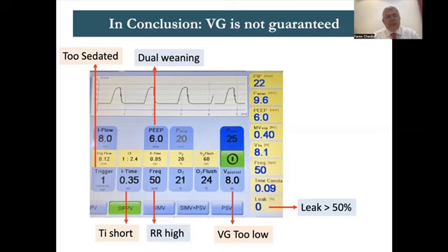Okay, the PEEP itself, as I explained, the dual weaning. If the baby gets healthier, I'm not asking you to decrease PEEP when it's needed, but if the baby gets healthier and you decrease the PEEP, the gradient between the PIP and PEEP will increase, and then as the volume goes up, the pressure will go down later. So decreasing the PEEP will force the PIP to go down, as I showed you in one of the slides.